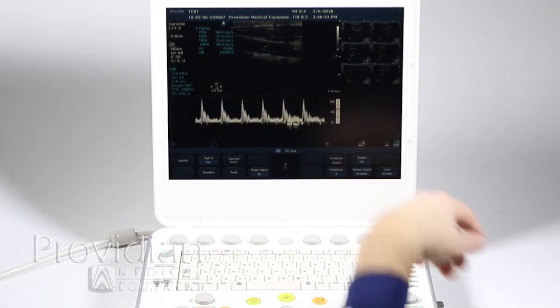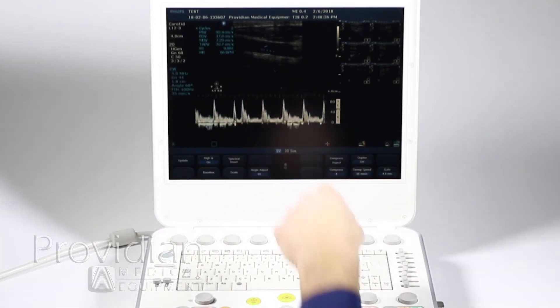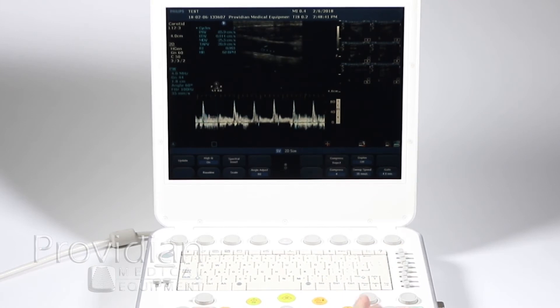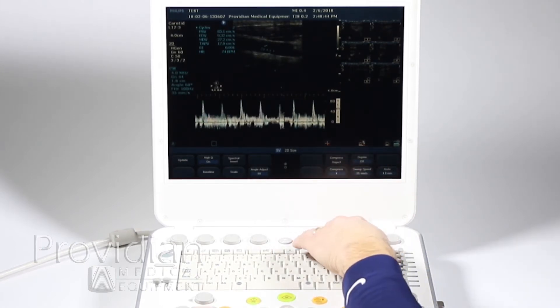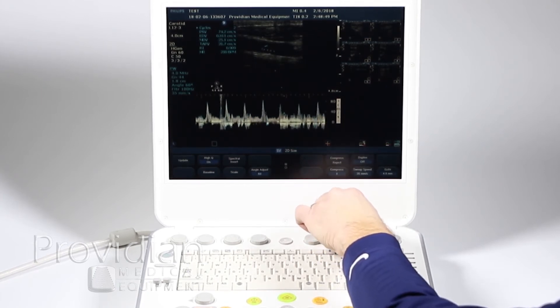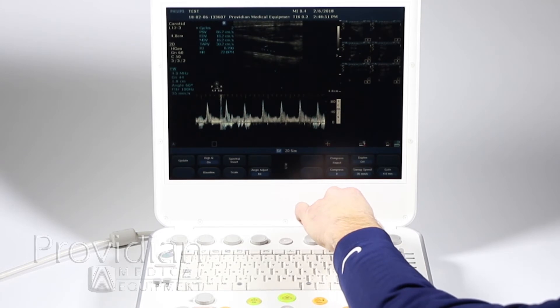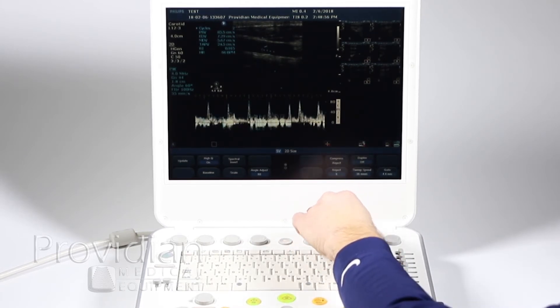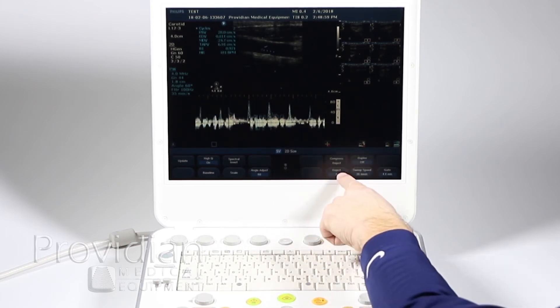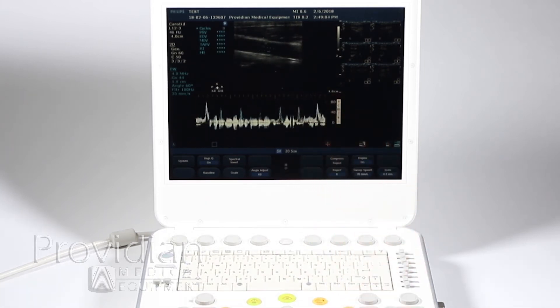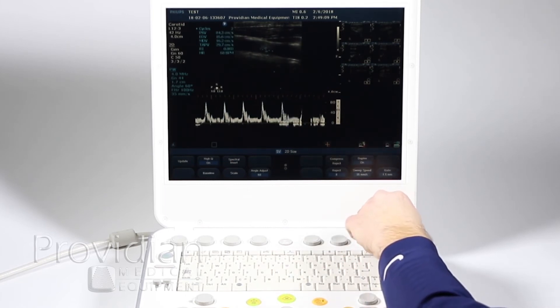Up here we have the auto calculations, which take an average of a few heartbeats. I don't have an ECG attached, but it still works. Over here we have compression and rejection. We can change the compression, and if we hit reject, that's going to get rid of some artifact in the image. Push down to choose compression or reject. Duplex for duplex imaging. And again, we can change that gate and make it a little smaller.